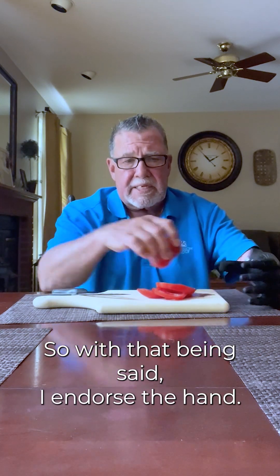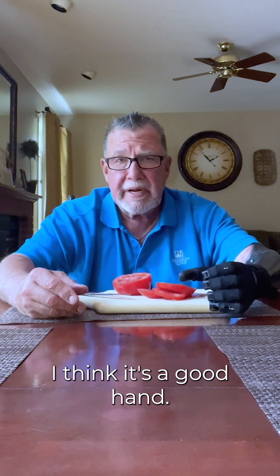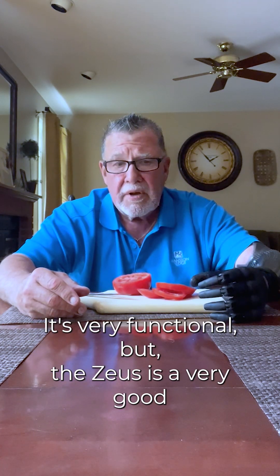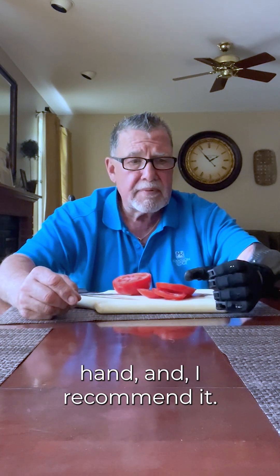With that being said, I endorse the hand. I think it's a good hand. Right now I'm trialing another hand that's very functional, but the Zeus is a very good hand, and I recommend it. That's about it.